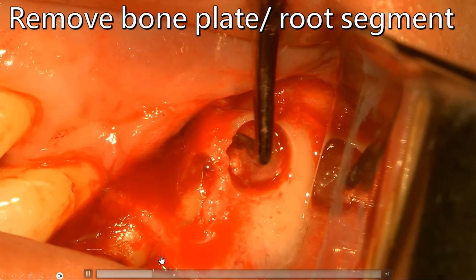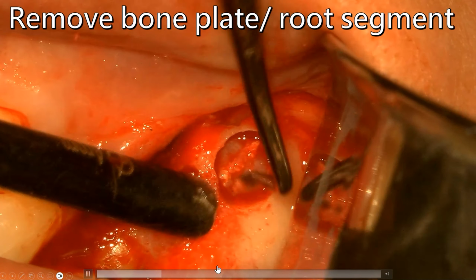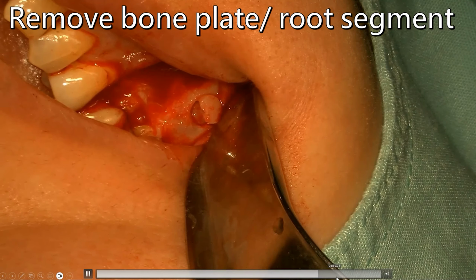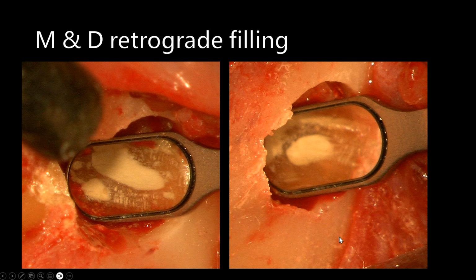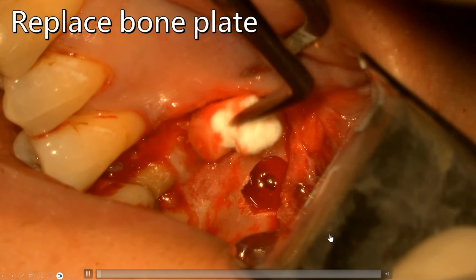Here is the bone window, here is the retrograde preparation, and here is the retrograde filling. I personally always put the bone plate back into the cavity. And this is the suture. This is the post-operative, and this was just done last month.